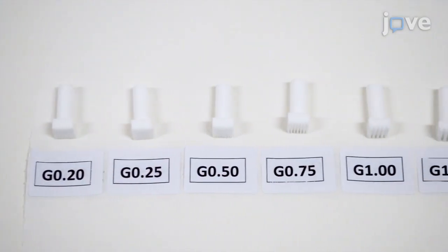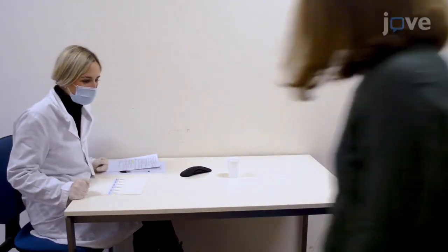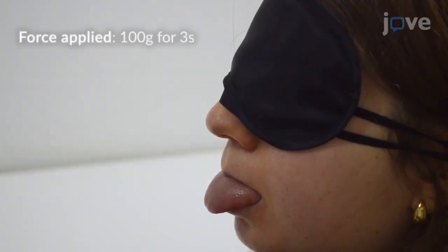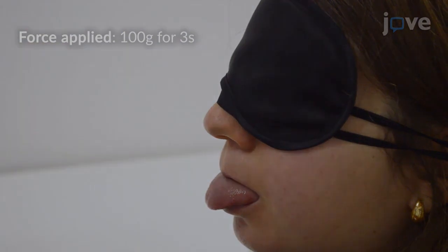Display all gratings on a table. Once the participant sits on a comfortable chair, inform the participant that they can leave the experiment at any time. Inform the participant that they will be blindfolded during the experiment and asked to stick out their tongue in a comfortable and relaxed way. To familiarize the subjects with the procedure, use the largest grating of 1.25 mm to demonstrate the force applied.